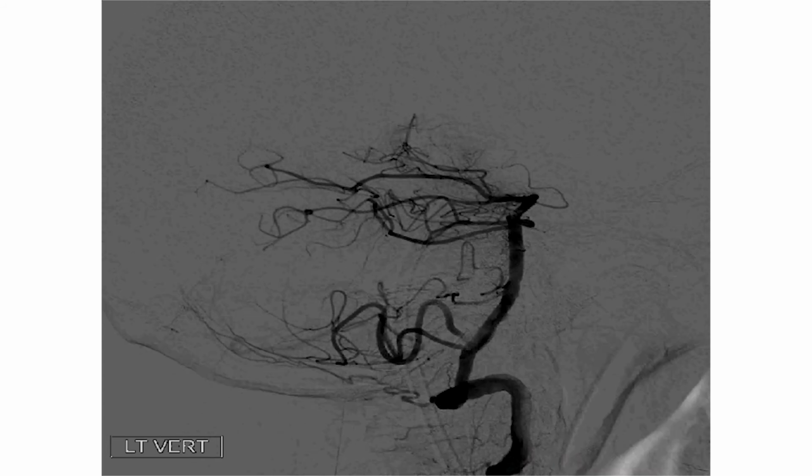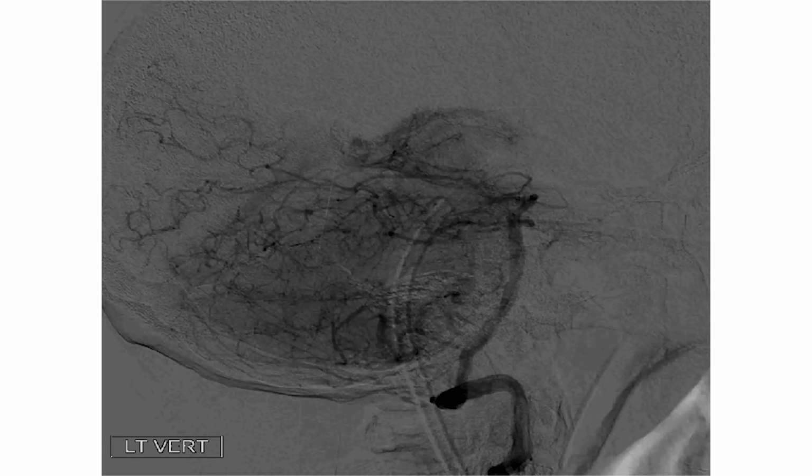So even though we weren't sure what the time of onset was, because of the severity of this, we took her straight to the cath lab and threaded a microcatheter up, deployed the solitaire device, pulled it out, pulled a big chunk of thrombus right out from her vessel, and in one pass got restored flow of everything here. And despite her age, which is definitely on the upper end of people that we typically intervene on, she woke right up afterwards and ended up with just a partial field cut to the left and very minimal diplopia, but it was otherwise completely neurologically intact. And she ended up going home after this.